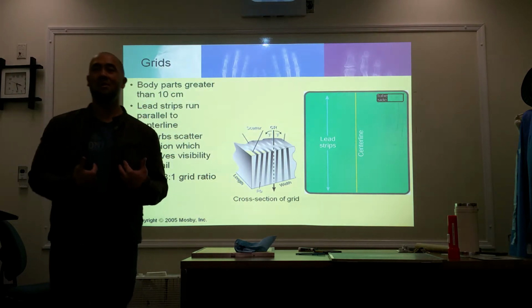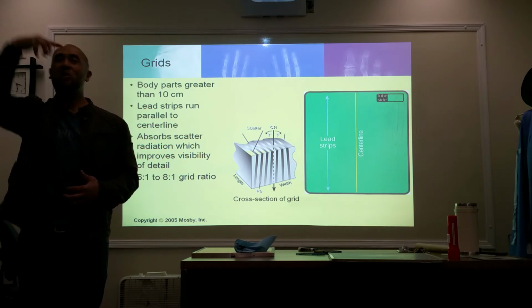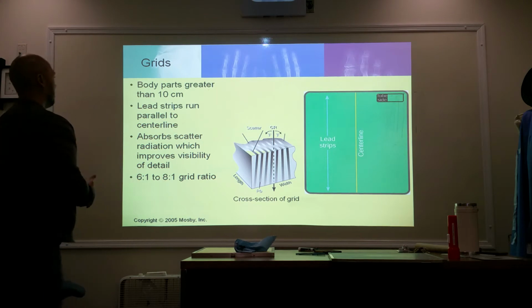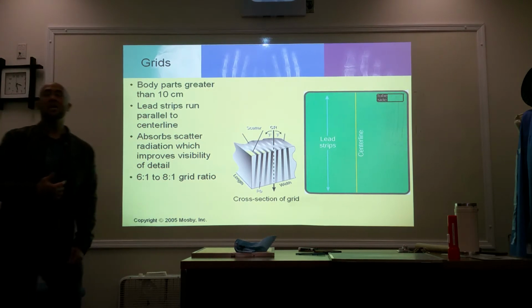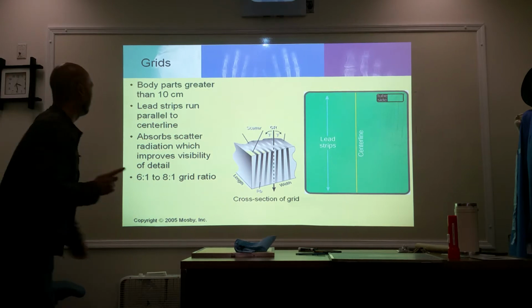You guys following? And then it gets thin right here, but then we get thick again up here. So we're going to use a grid for our skull. So basically, just like your extremities, you don't need it. For thicker body parts, yes, you do. Okay?